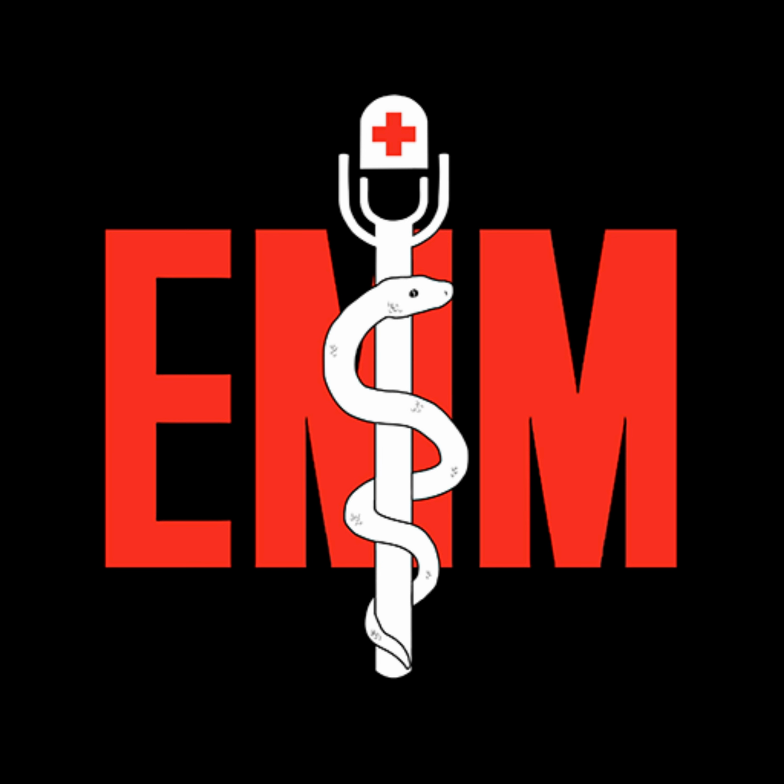One other thing I think is useful with it is for cases where you're trying to see if you have mechanical capture. Someone has a transvenous pacer or a pacer on. We don't care about the electrical capture. We care about blood going to the body. And so the pulse ox will tell you that, right? You have an electrical rate of 80 on the monitor, but only 40 on your pulse ox. You don't have capture, right? Because we're not getting 80 beats per minute to the fingertip.